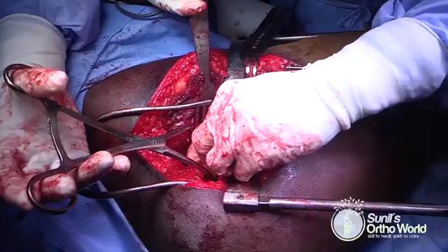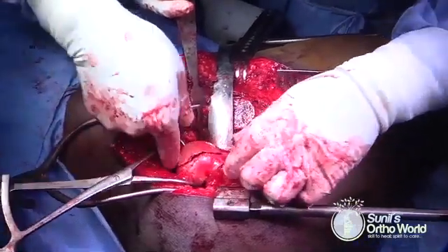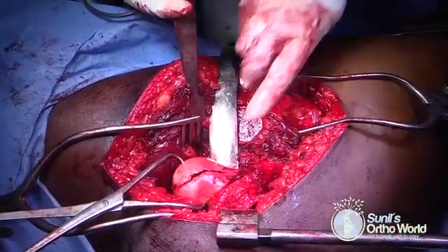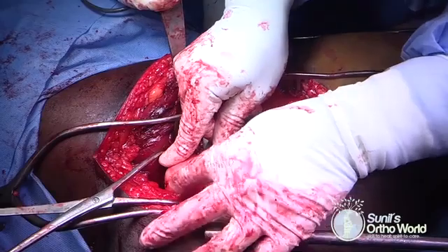Having ruled out labral lesions, the fracture is now reduced and held in place by using a pointed Weber clamp. Fracture reduction is checked all around and is found to be anatomical.